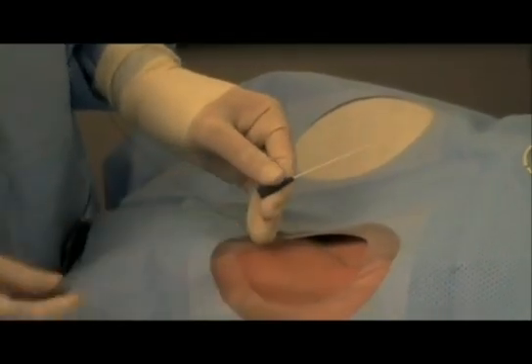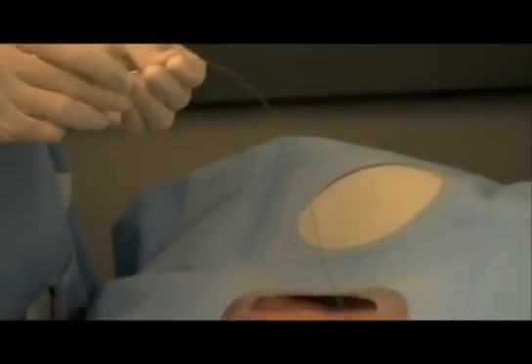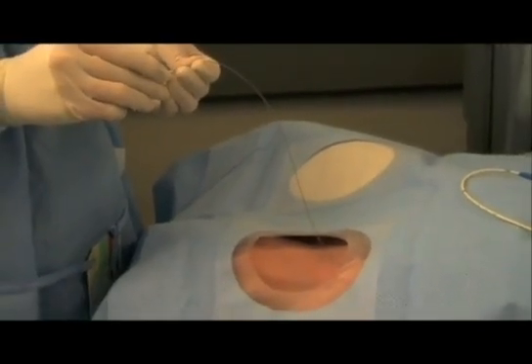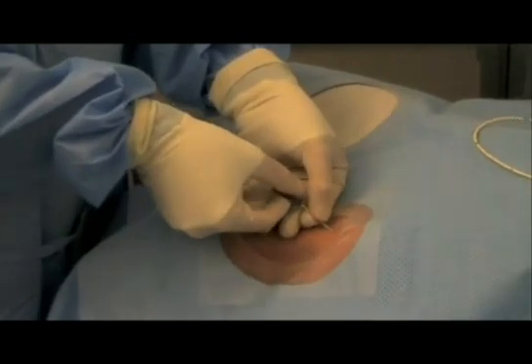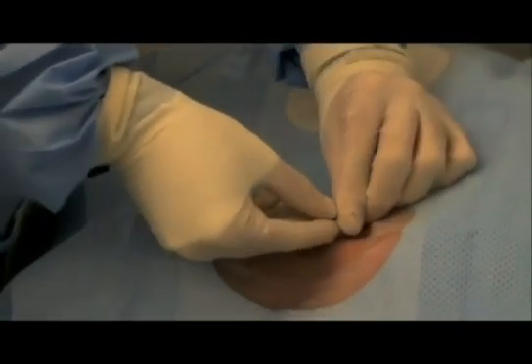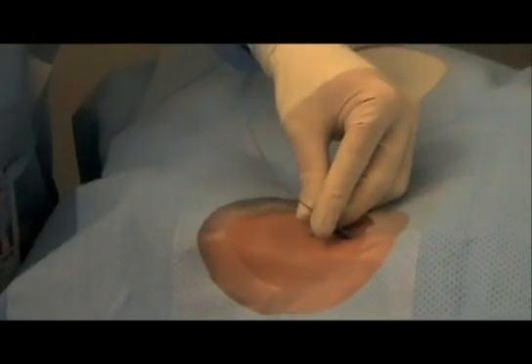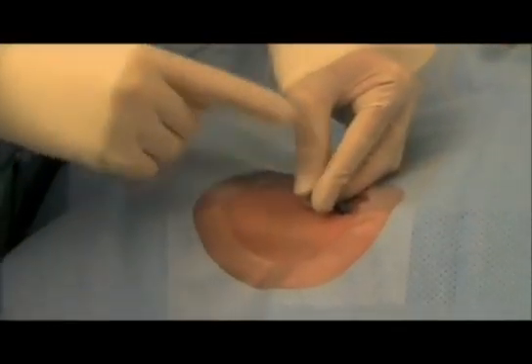We're going to take that angiocath off and actually thread it over our wire. That should go in without any dilation — you can just pop that angiocath into your vein. Now the wire comes out, but save it, you're going to need it in a second, so keep it fully sterile.